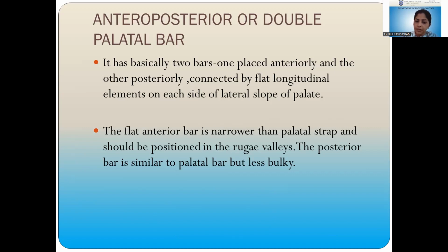And we should always make sure that the anterior bar follows the valleys of the rugae, and the border should end in the valleys of the rugae.